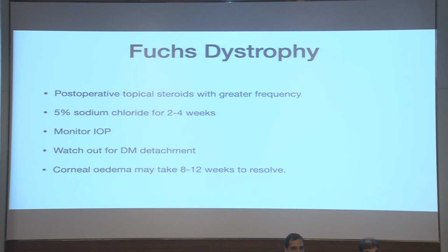That means you have a patient, explain to the patient what the position is, do an ASOCT map, look at the pachymetry values or do Scheimpflug imaging. And then every week when the patient comes or you're reviewing it, do the pachymetry again. If you see your pachymetry is getting better, then you know that the eye is improving.